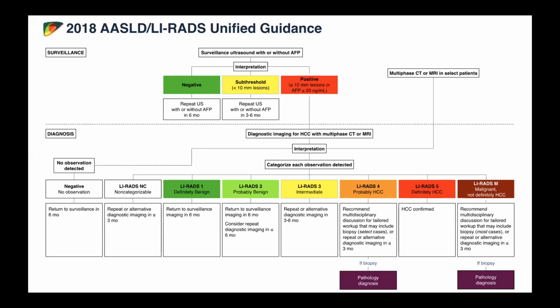Now, once I've shown you what is capillarization, and what the important features you need to look for are, this is the LI-RADS AASLD algorithm, and this basically tells you how we've incorporated LI-RADS into the AASLD algorithm itself. Prior to 2018, LI-RADS was a standalone radiology document supported by the American College of Radiology. It was made by radiologists to be used by radiologists. Of course, there was a clinical input as well as an output in part of it, MDTs. But as of 2018, LI-RADS got merged into the AASLD algorithm, and we were able to be part of clinical algorithms for the first point in time.